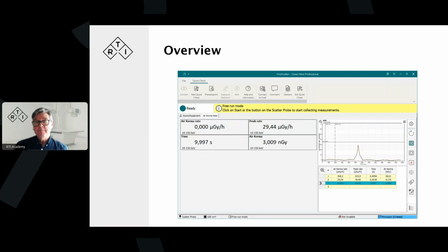Well, I had one customer looking at that, and they found that they had 0.04 microsievert or mR per hour, which happens to be the drift value, the maximum drift in an ion chamber based survey meter.